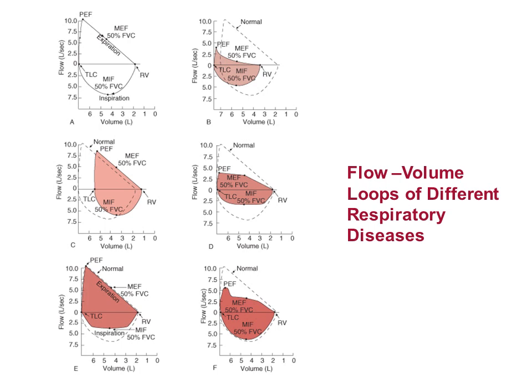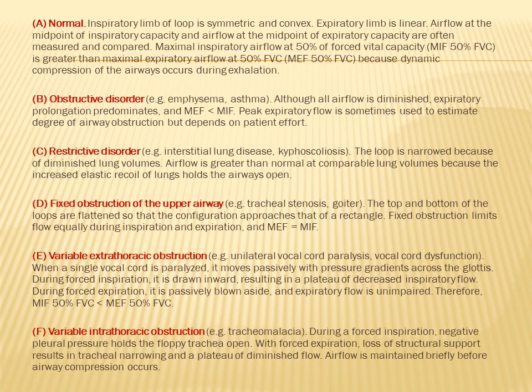As you can see, spirometry is essential to diagnose many diseases. This slide describes the cases presented in the previous slide. Please read it carefully to understand each figure we discussed before.